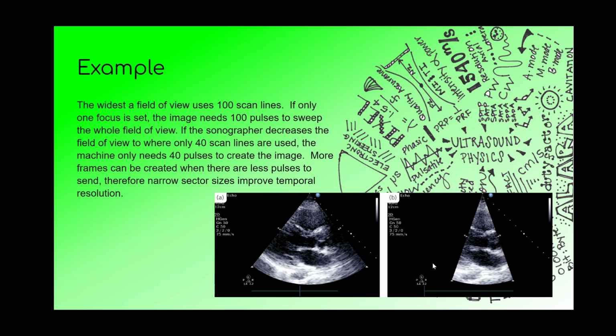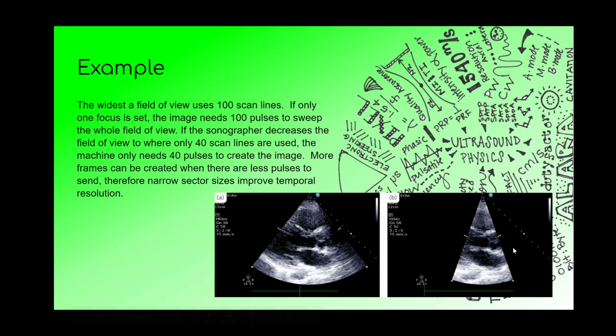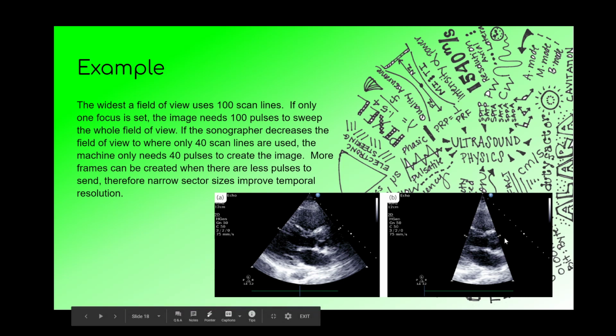So that is another reason why we tell you to decrease your depth to only the anatomy that you need, and then bring in your sector again to only the anatomy that you need. And this is especially true if you are imaging structures that are moving.